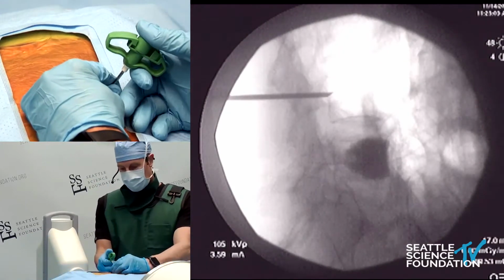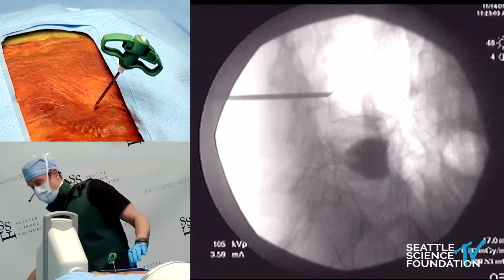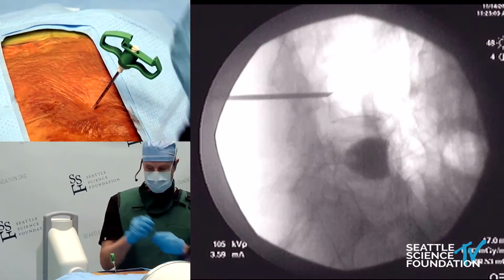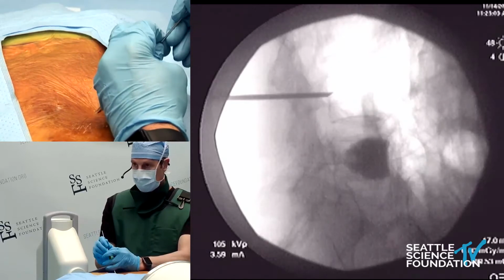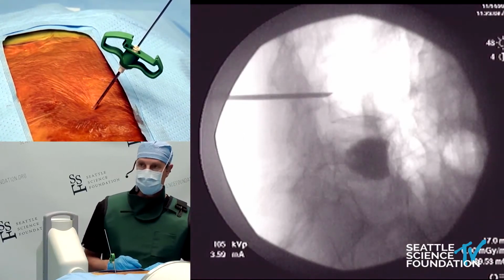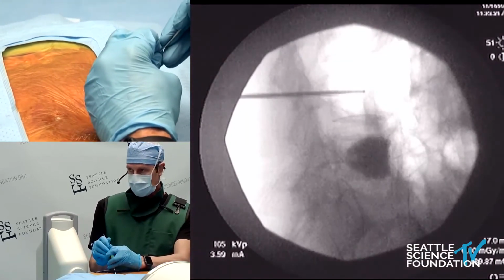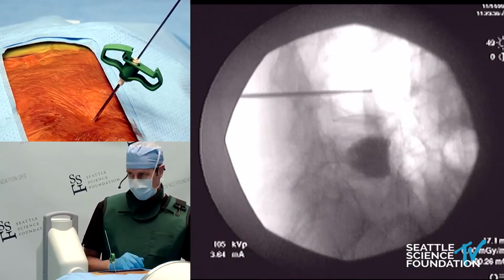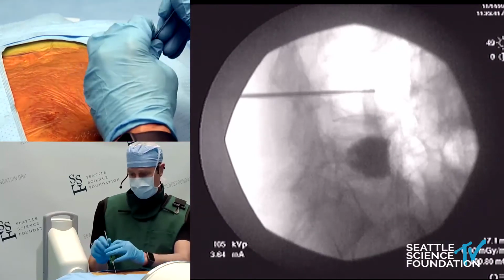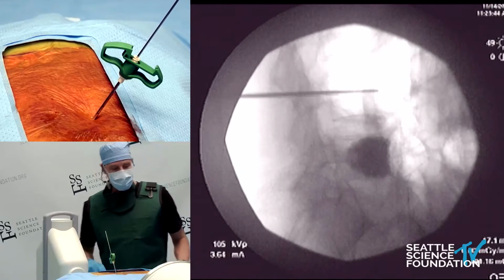And I'll go ahead and place this in. Stylet comes out, K-wire goes in. At this point in time, what I like to do is place the K-wire, most of the time just halfway in. But what I want to do is demonstrate to you where the final position of the jack will be. So right up against the anterior portion, not quite there, but maybe right about there. Okay, let's come back and take an AP shot of that.